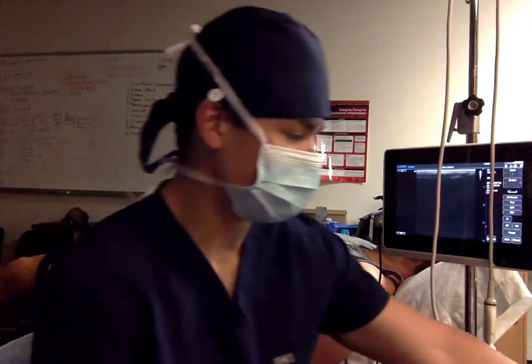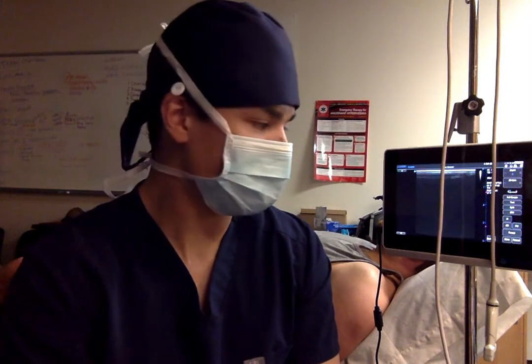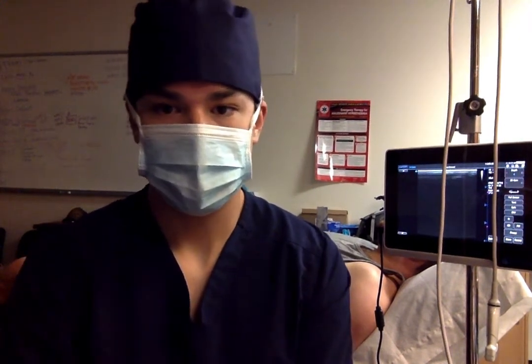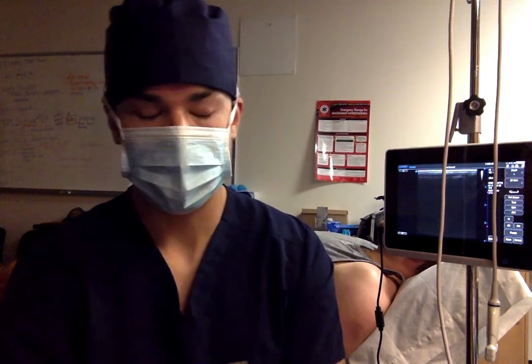We're going to get my patient hooked up to all the vitals. Just the normal stuff: blood pressure cuff, EKG, and SpO2, and tidal. We can do this after induction, so all the vital sign monitors will be on them already. We'll do a timeout, identify the correct patient, procedure, block, and sides. It's going to be bilateral today.